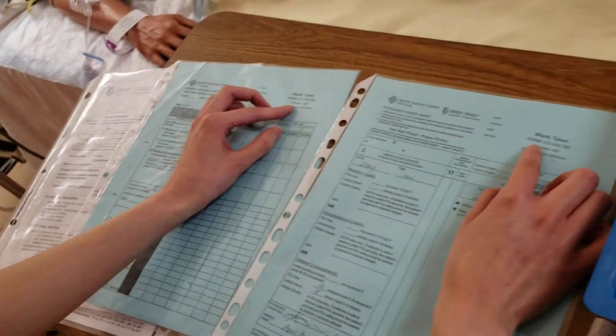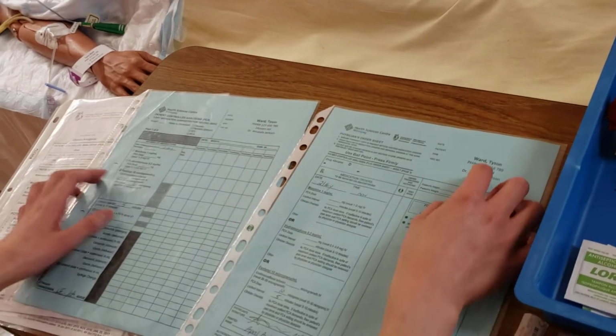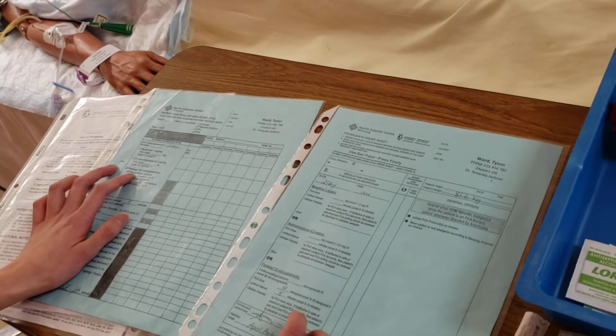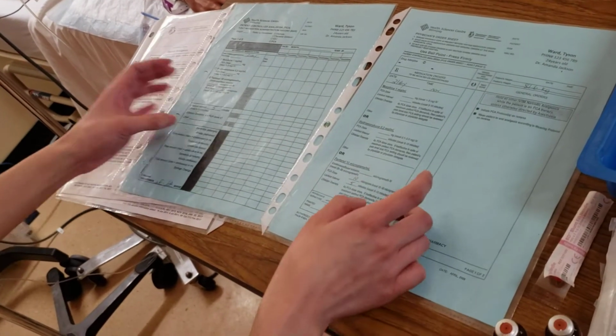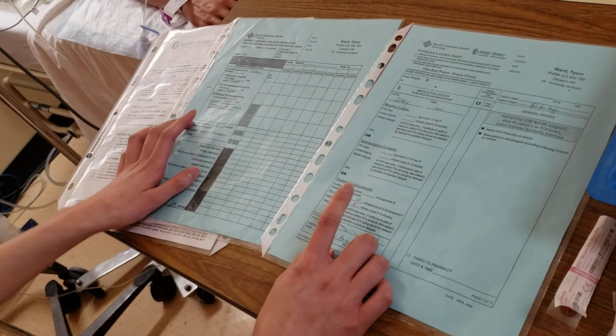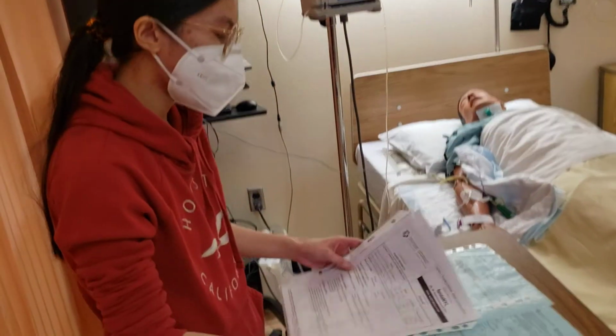Ward Tyson, PIN number 123456789, 24 years old. Once again, same for the MAR: fentanyl 10 micrograms, PCA dose of 10 micrograms, and a lockout of 5 minutes. It's been transcribed twice, and once again, we have to look at the PDM.